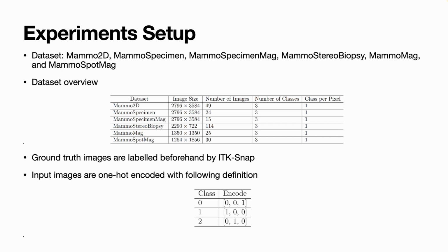As you can see here, the first table shows that they have different sizes and quantities. The quantity is obviously low in number, which is also a difficulty in training a deep learning model.